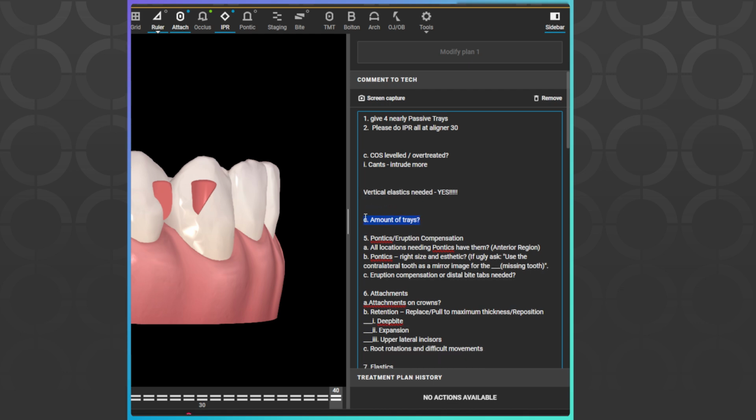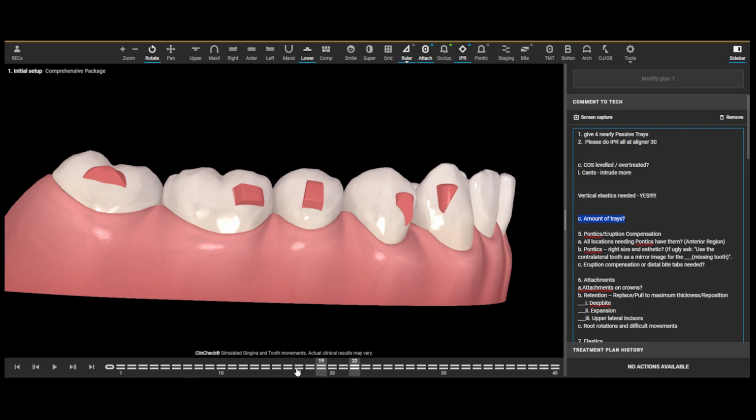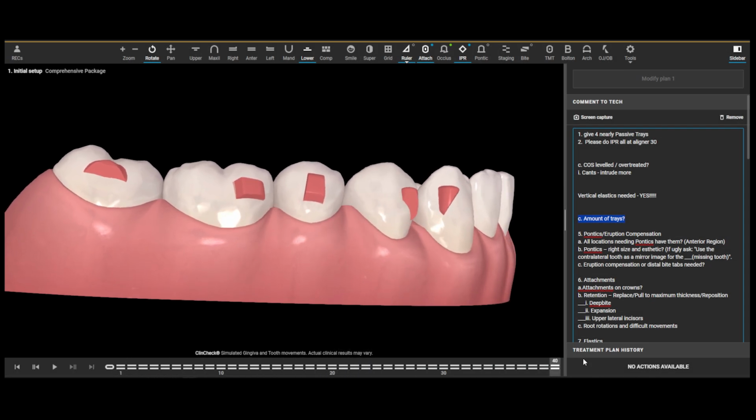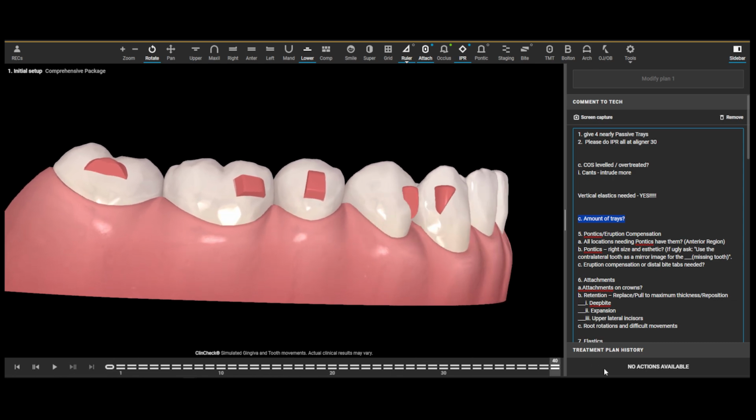Okay, next thing, the amount of trays. Is the amount of trays okay? Well, how many trays do we have in this plan? We have 40. Is 40 trays with weekly changes going to be enough? Well, 40 trays being 40 weeks means that we're looking at what, 9 months, 10 months? I think that's all right for our first batch, so I think we're okay.